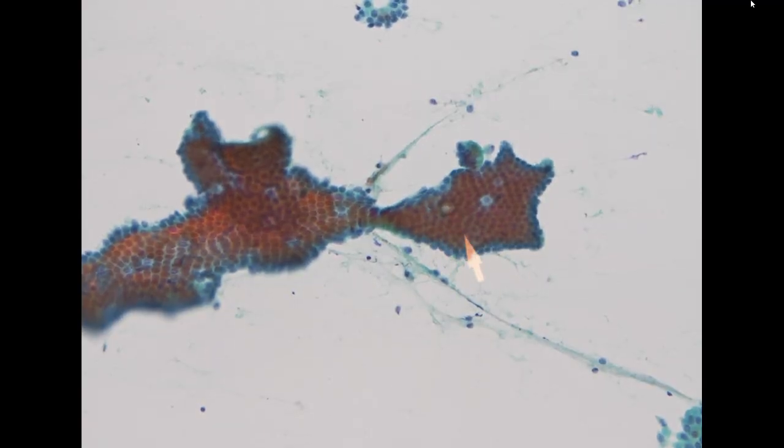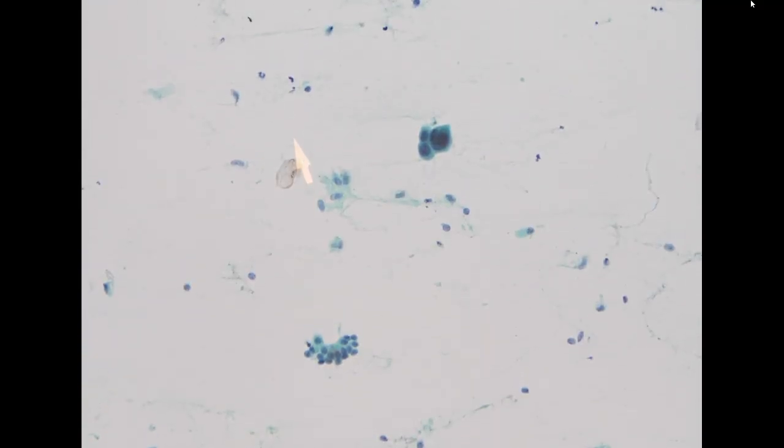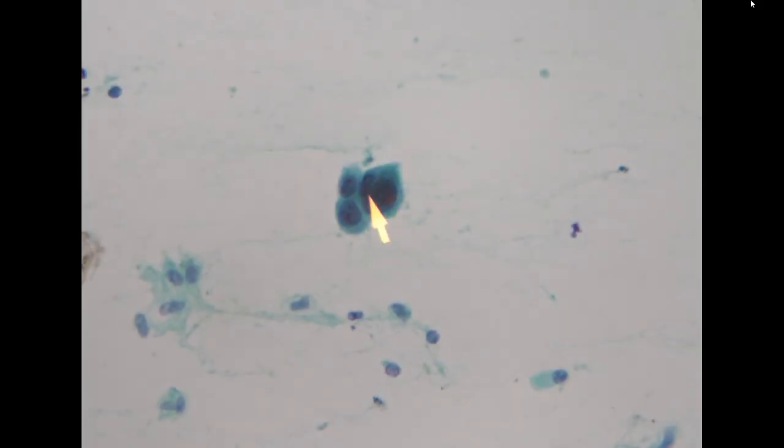You can appreciate the honeycombing arrangement, and there are scattered goblet cells in these nicely oriented fragments. Right next to these benign-looking cells, these are very high-grade tumor cells in a tight cluster.